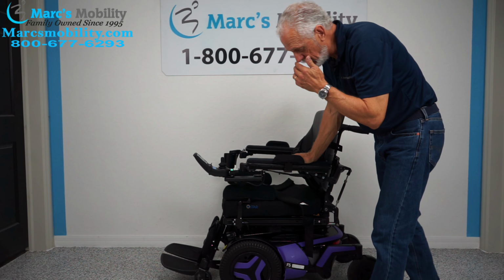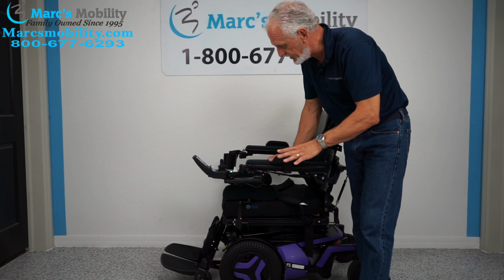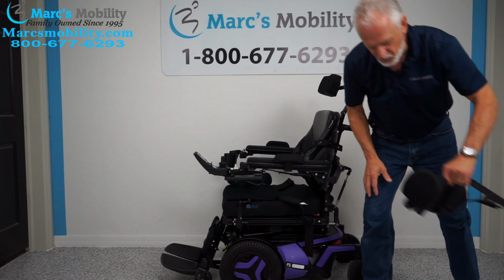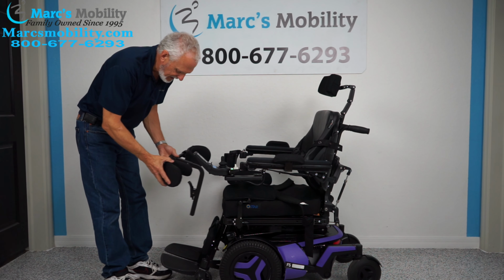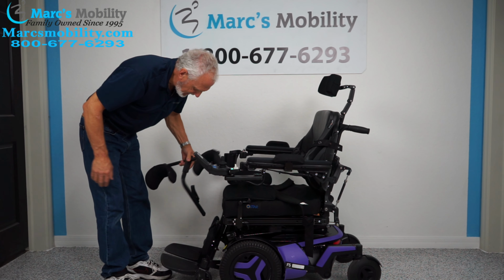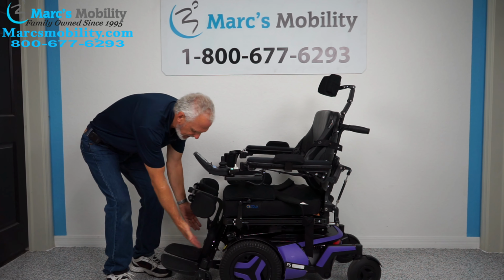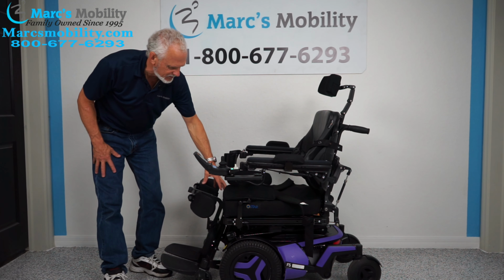So the first function we're going to show you out of this chair is the standing feature. That's probably why you're watching this video. So if you're going to stand someone, the first thing you have to do before you stand the chair up, you want to make sure you put your knee brace in right here, like this, on the front of the chair. And you want that knee brace to go in when the feet are in here. If the feet are up, you're not going to be able to get the knee brace in. You're going to be hitting the patient.